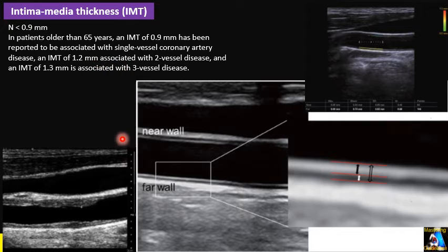So the measurement for prognosis and evaluation of those, especially people over 50 to 65 years old, is very useful and is recommended we do in all patients.